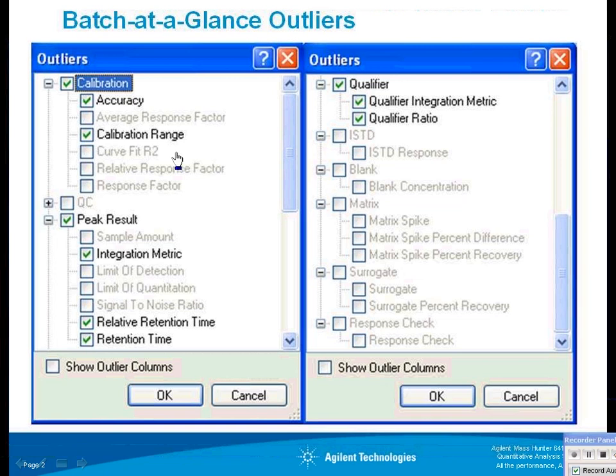So as an overview, we have 20-something outliers set up for you. Only certain ones are turned on by default. You've already run into the fact that we have given you accuracy, which applies to the calibration samples and QCs. We also warn you if a sample is quantitated outside of the calibration range, meaning the lowest and highest level that's active.